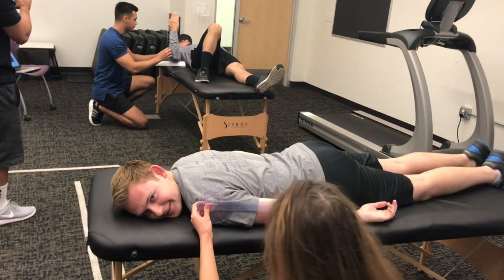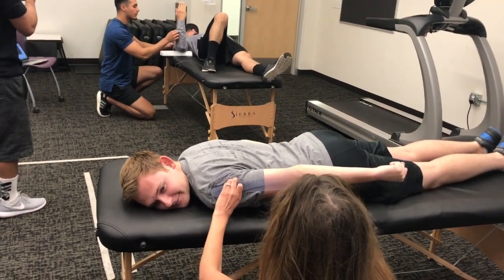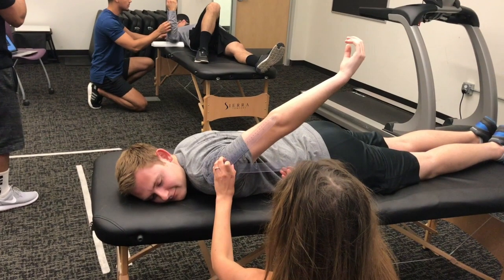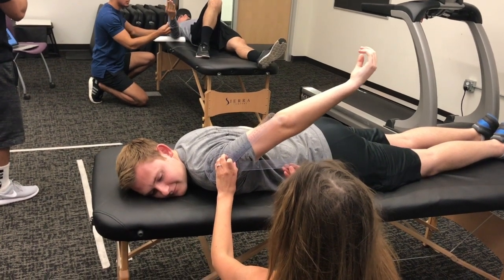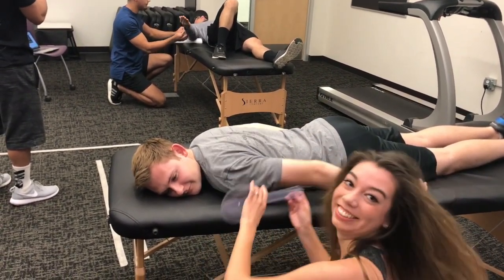Have your partner lie prone with the arm at the side, keeping elbows extended and not rotating or abducting the upper extremity. The axis of rotation is the greater tubercle. The stationary arm is parallel to the thorax and the mobile arm is down the midline of the humerus. His measurement is 62 degrees. The normal range of motion for shoulder extension is 60 degrees.